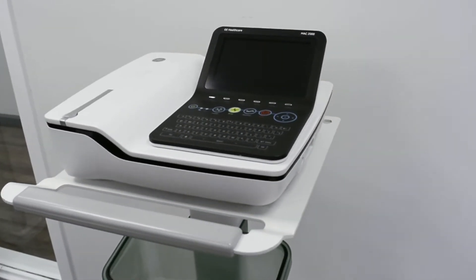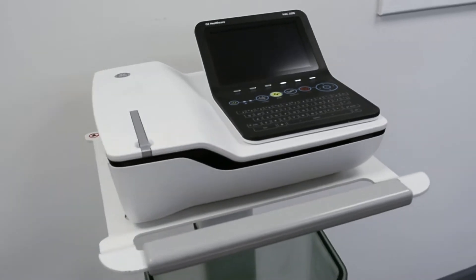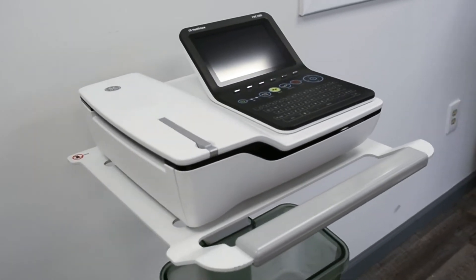The MAC2000 has two main modes of operation that include resting ECG mode and arrhythmia mode.